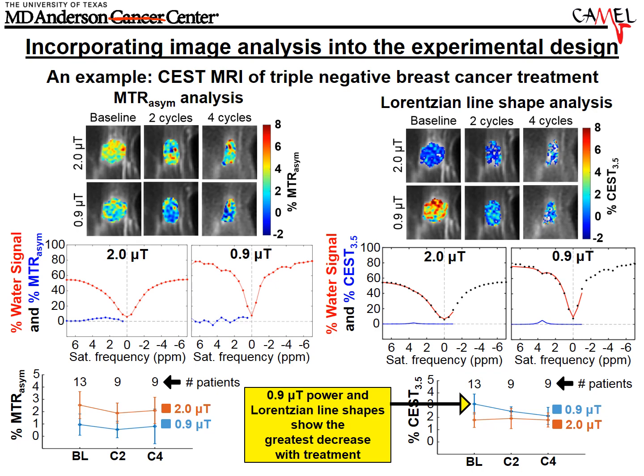I'm sure many of us have seen cases where the acquisition is performed, and we have a stack of images, and then we start to think about the analysis and realize that the acquisition could have been performed in a slightly better way to be complementary to the analysis. So yes, analysis has to be part of the study plan up front.